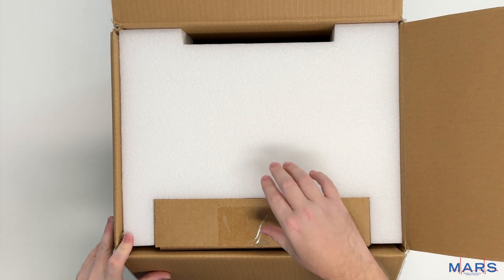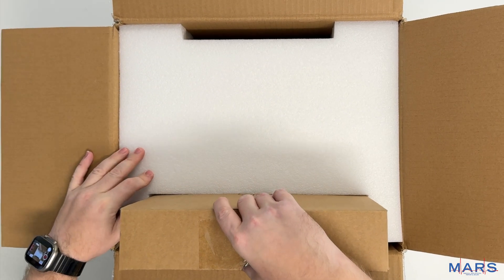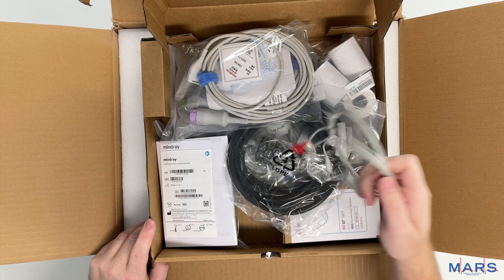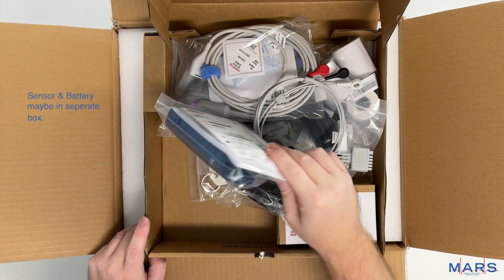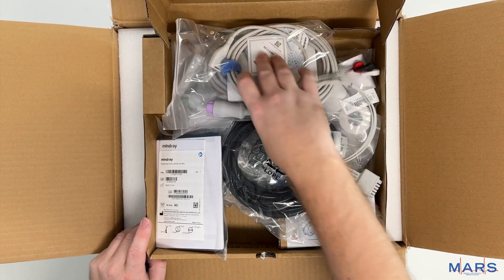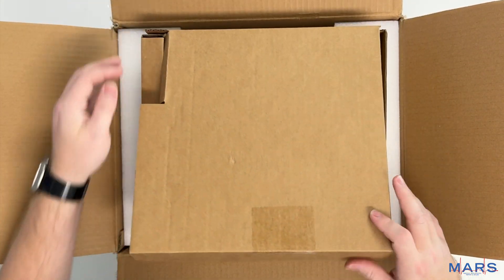When you first open the box you'll have a smaller box over here to the side. Within this box you'll have all your accessories: your lead wires, your power cord, your sensor, your battery will usually be stuck up in here, paper, extension cords, temperature probe cable, and all that good stuff.